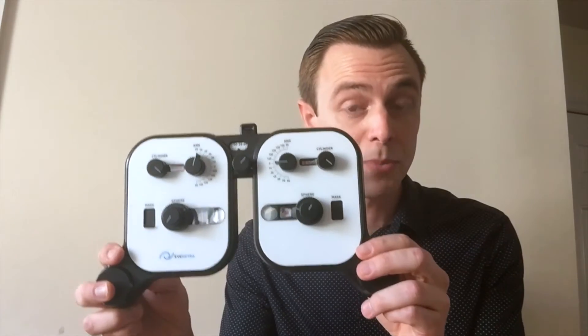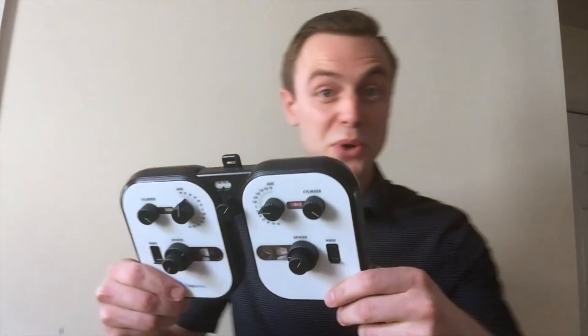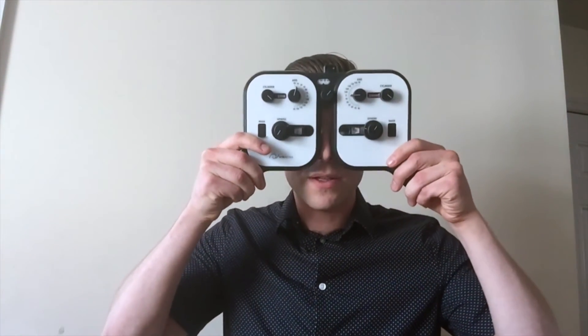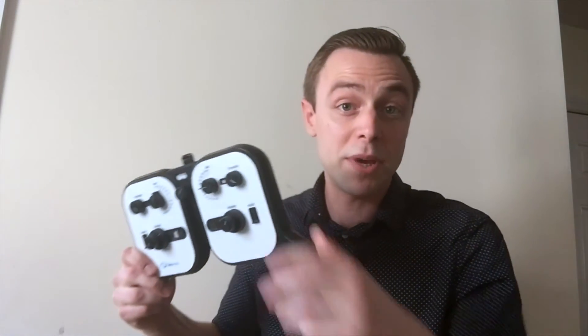So the eye doctor would dial in all the appropriate values into the Netropter and hand it directly to the patient. No need for any specialized furniture. The patient themselves would hold the Netropter, look at an eye chart, or maybe at a near vision chart.